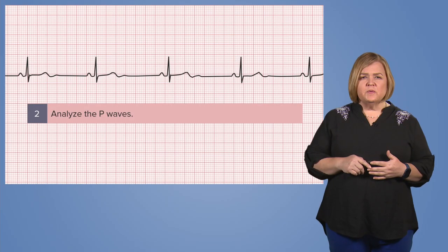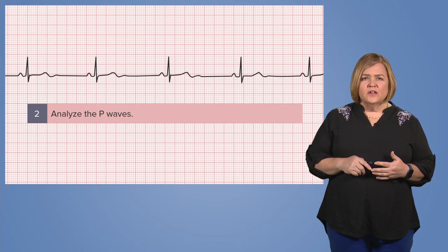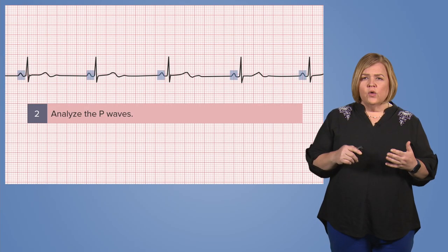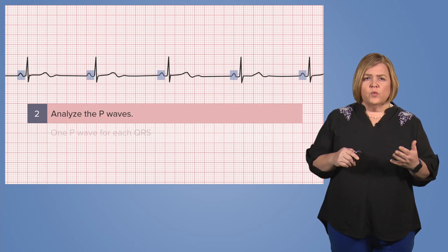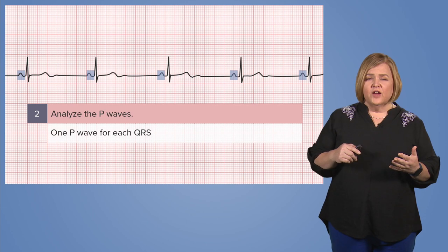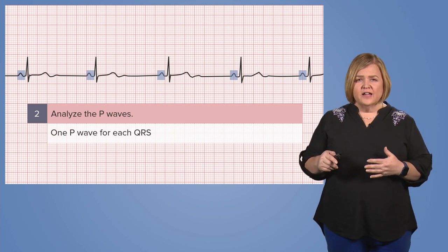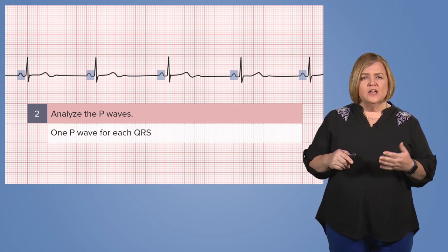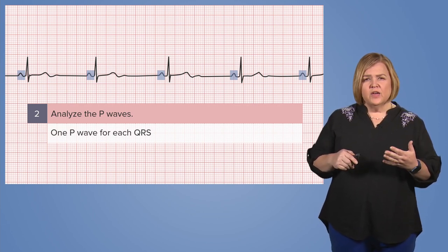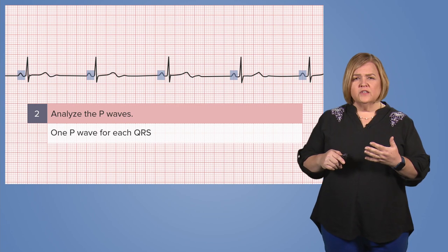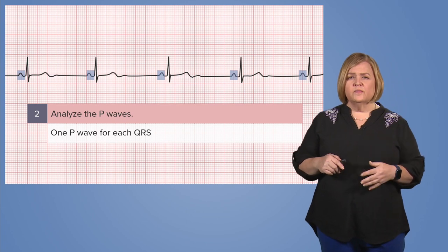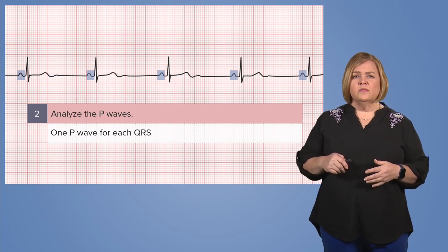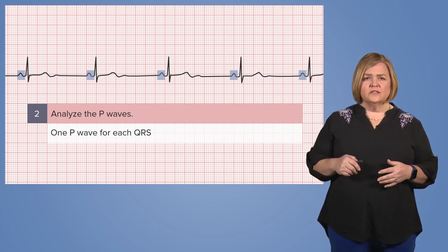Now let's look at the P waves. Are they all there? Do we have one P wave for every QRS? We do. Do the P waves all look the same? They do. Excellent.